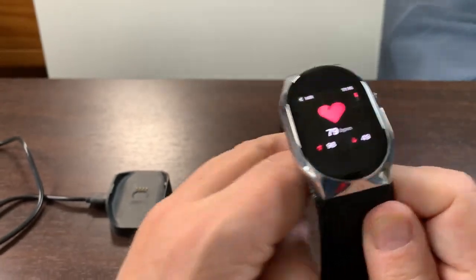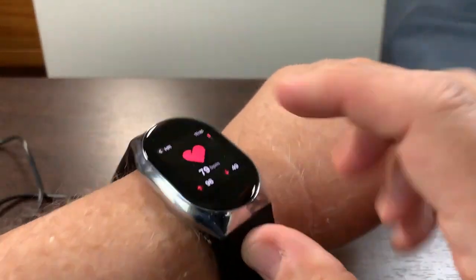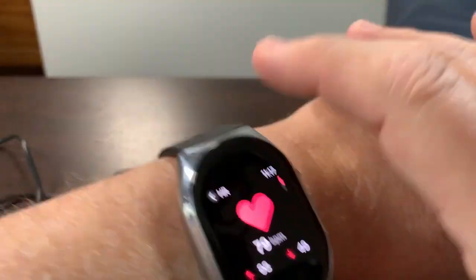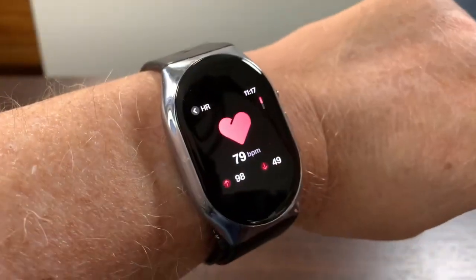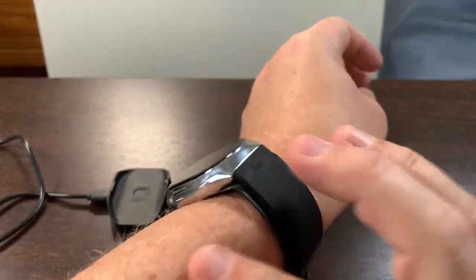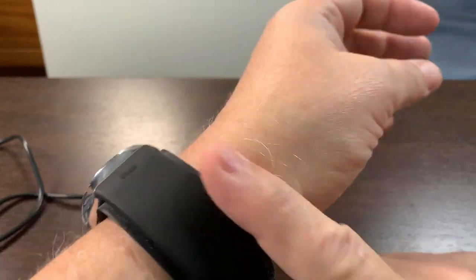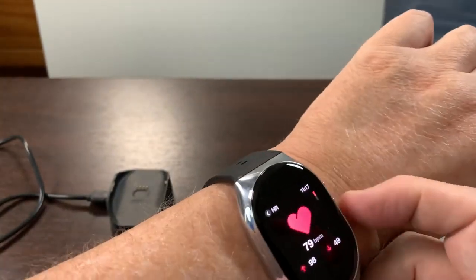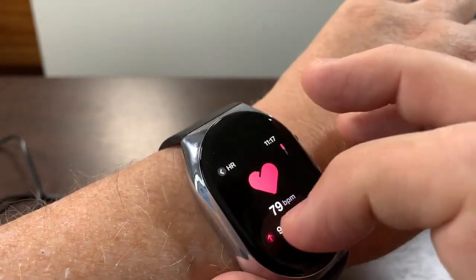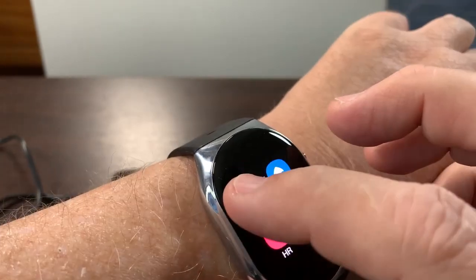When you put this on your wrist, I'm going to show you where I put it. What you get in the box is a measuring tool. You want it much lower than a regular watch — closer to the hand but not too close. Let's go to blood pressure.